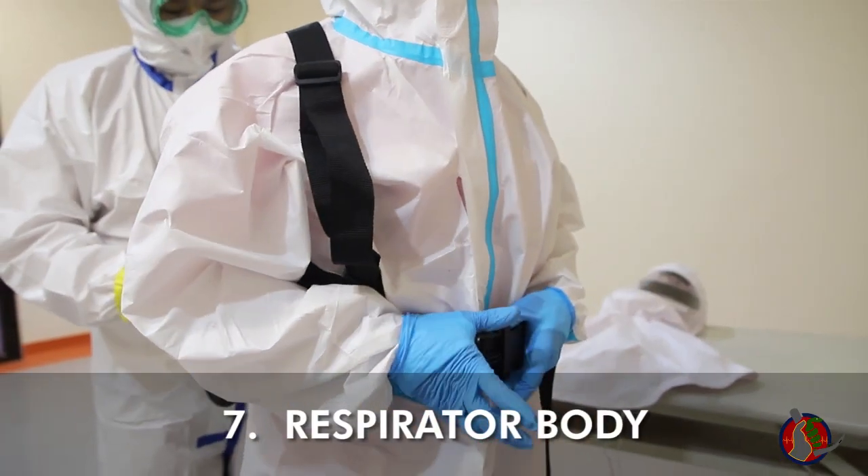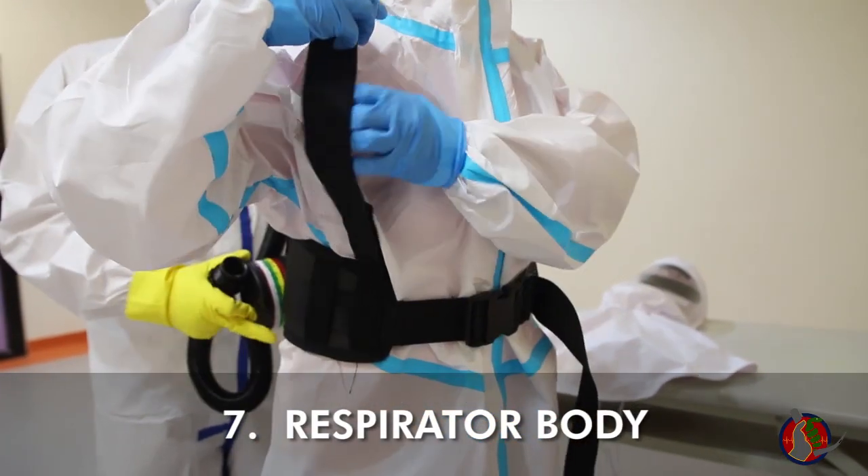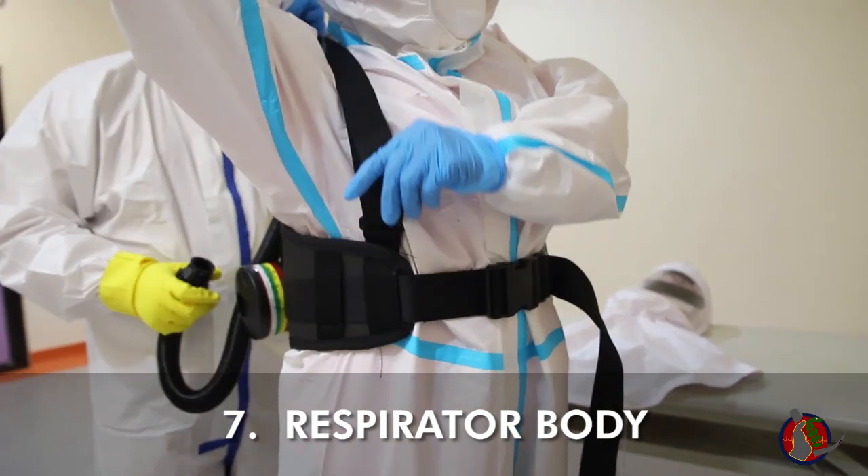Lock the clasp in place and adjust the straps to fit, so the machine rests on the small part of your back.